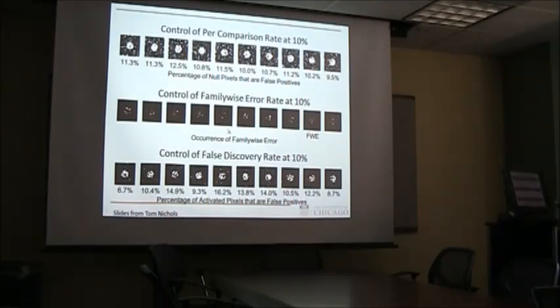That's how your ideal statistical test would be. And of course, it doesn't happen, so there's some trade-off here. What you'll see is that in each case, there are a couple of parts inside this red circle where we declare our signal statistically significant, but also a lot of stuff which we should declare statistically significant, we don't.